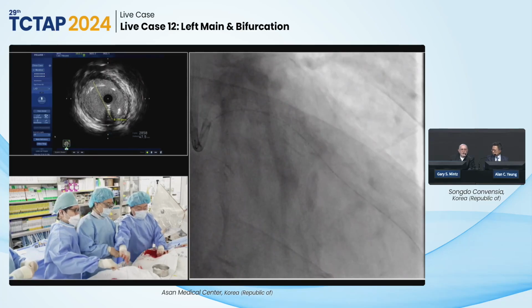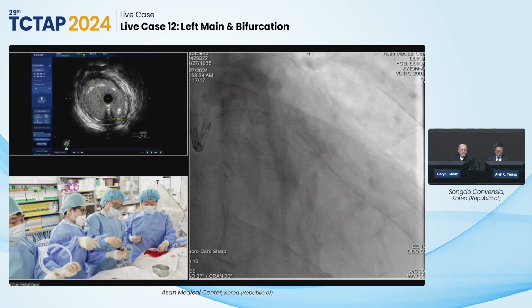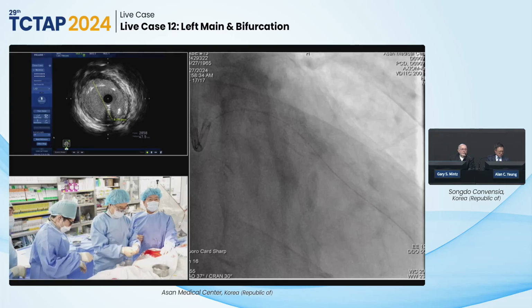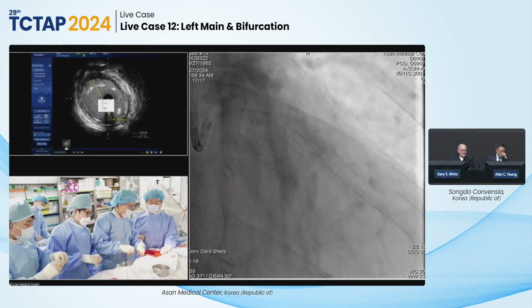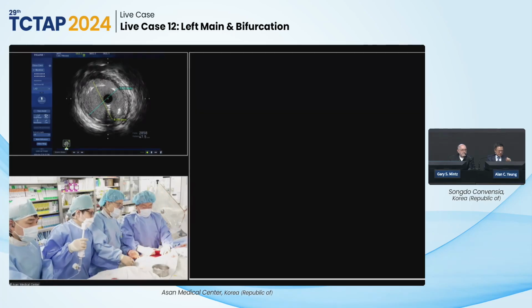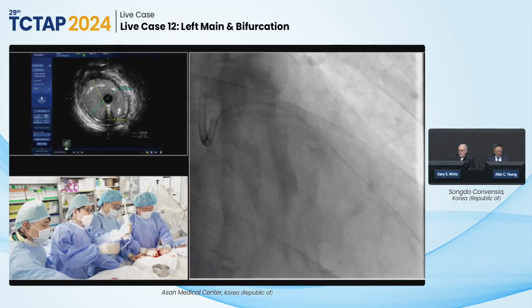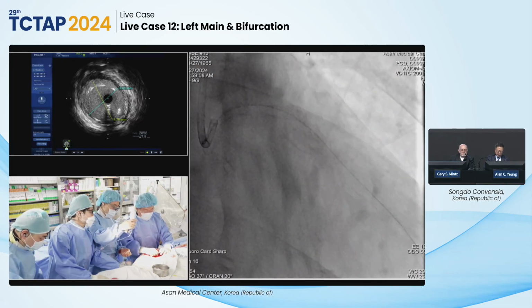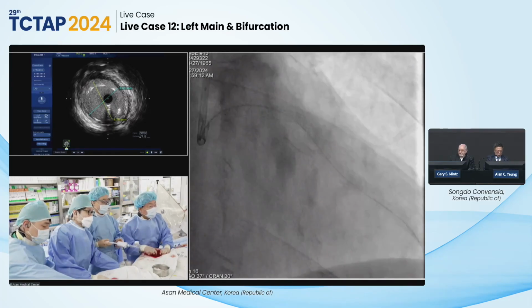For the audience, that degree of malposition at the proximal edge does not affect restenosis or stent thrombosis or outcomes. Right. But if the patient comes back to the lab and you have to rewire the LAD or the circumflex, you've got a good chance of getting your wire behind the stent. Absolutely, yeah. There was some chance of abluminal wiring. Effective stent area concern is quite enough. However, you're going to make it more complete. And if you think you can avoid it, the very proximal part.